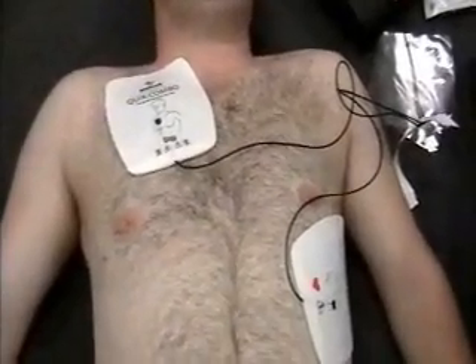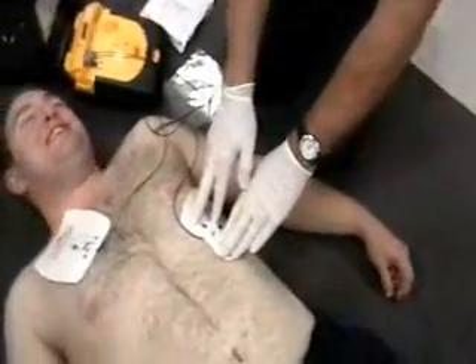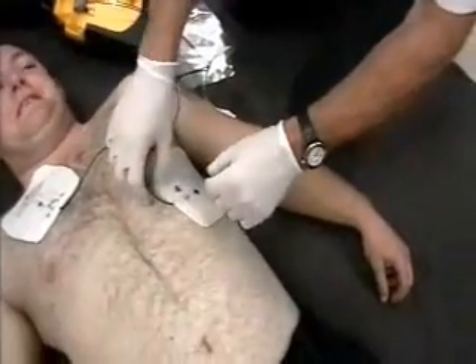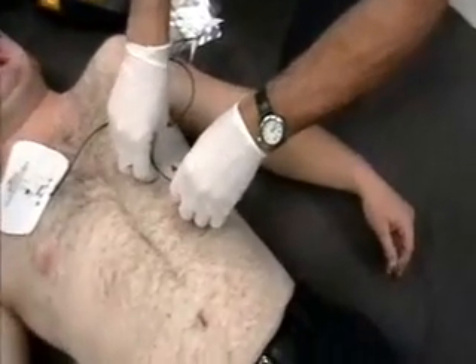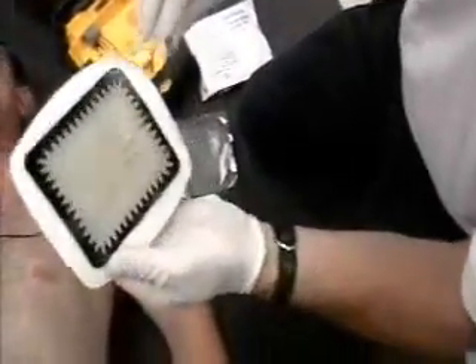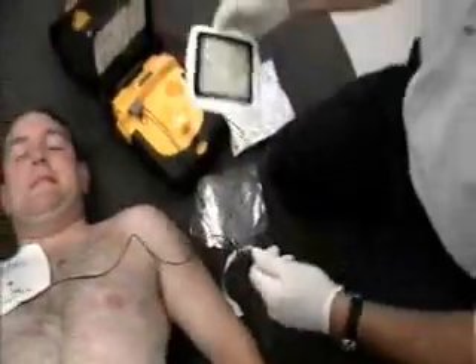Now I think we just need to rip them off. So we're going to actually start with this one. Ready? One, two, three. And we can see that it took off a little bit around the periphery mostly, where it's sticking to my glove actually. It's a very sticky area, but not in the gel portion itself.